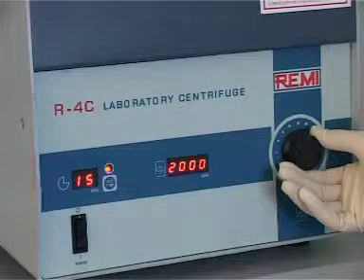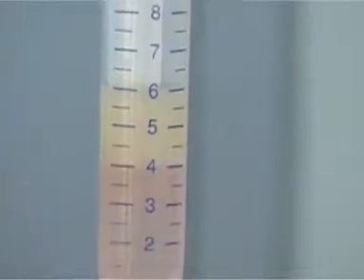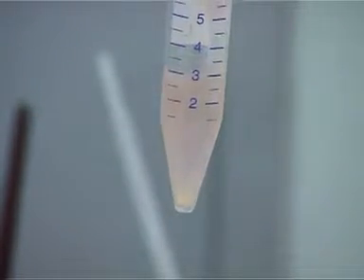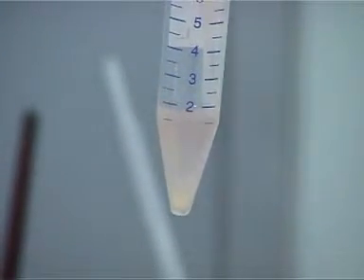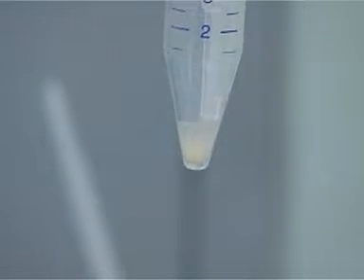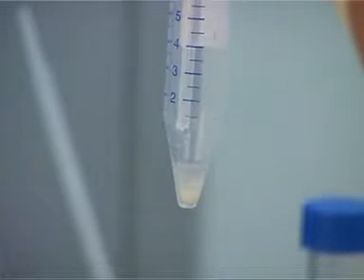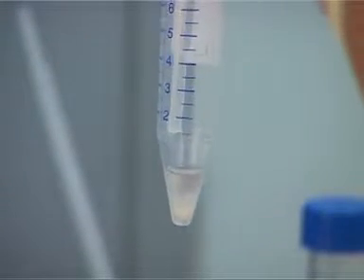Centrifuge at 2000 rpm for 15 minutes. Remove the supernatant without disturbing the pellet. Add 2 ml of semen washing media to the pellet.